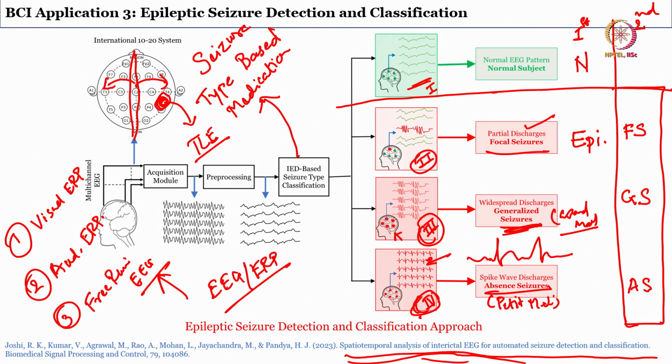That is why it is very important to record EEG and ERP, understand EEG and ERP, and design a proper, structured experimental protocol before moving to any experiment, identifying several aspects of ERP-based or EEG-based experimentation.